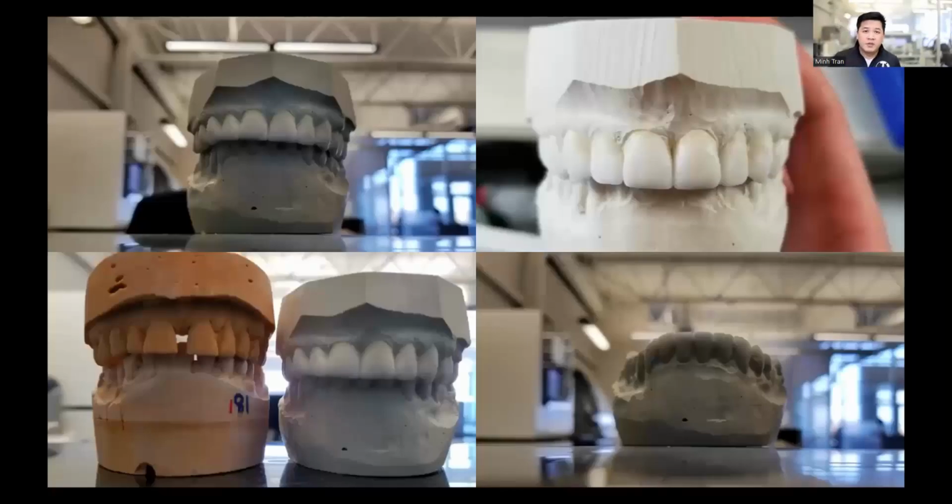So doing diagnostic wax-ups by hand back in the day, you were basically stuck with whatever style you as a technician were capable of producing. So these pictures here, I'm regretfully putting up because at the time I thought they looked fantastic, but looking back at it now, they're not really that great, to be honest. But again, that was what I was capable of producing so many years ago.